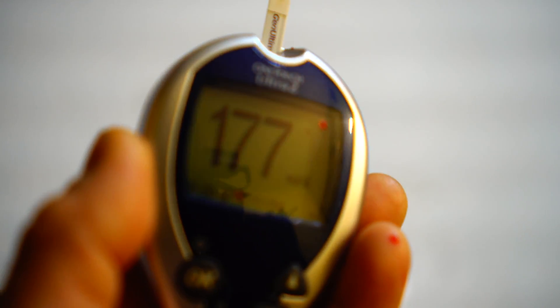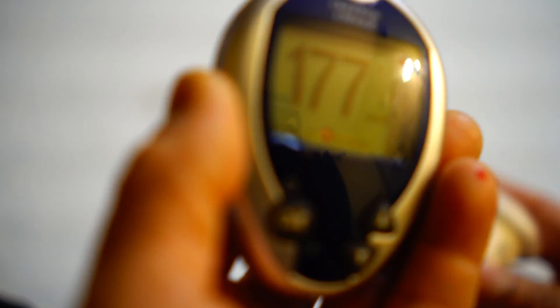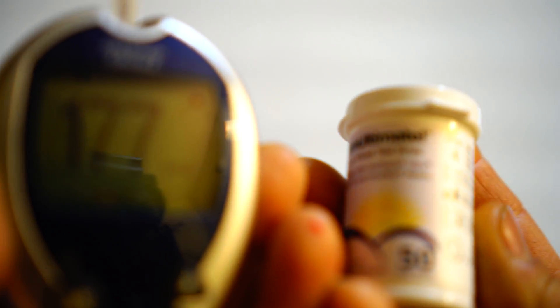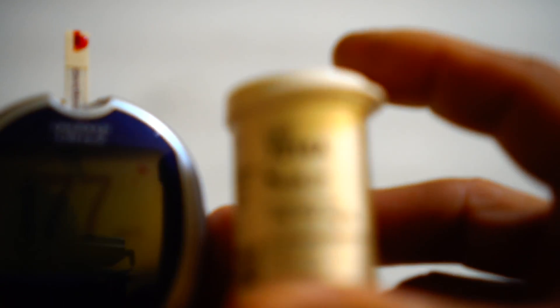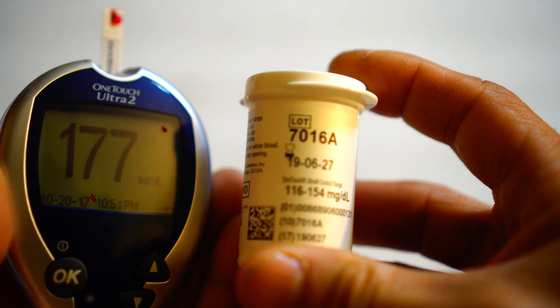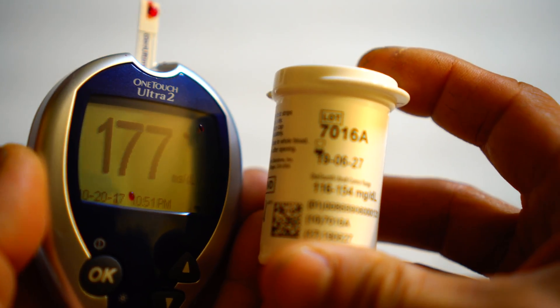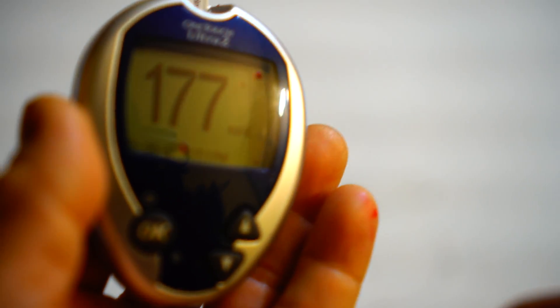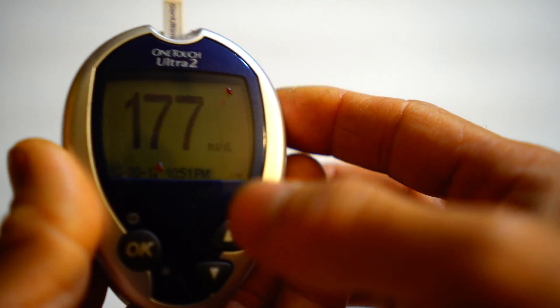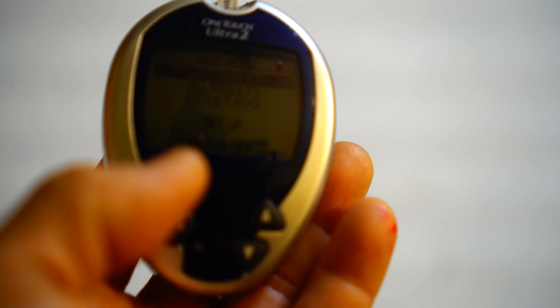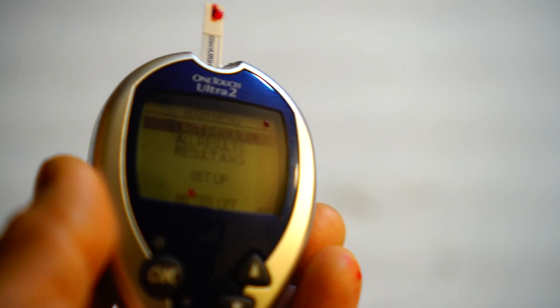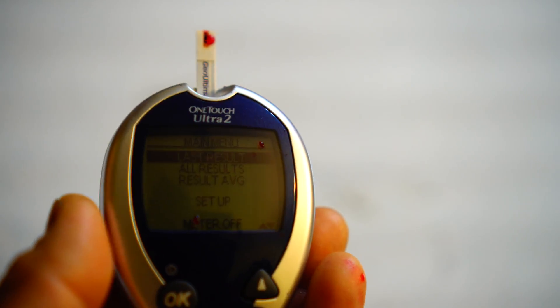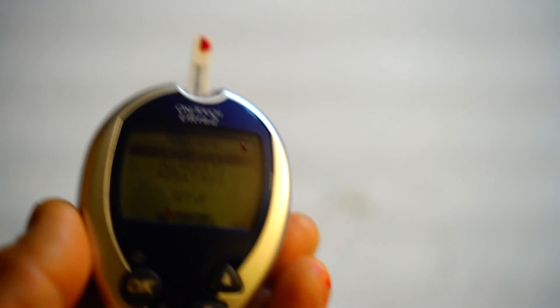177. The vial calls for control solution between 116 and 154, so you can see this is out of range. This is not the only one—many strips I've tested are coming out of range.